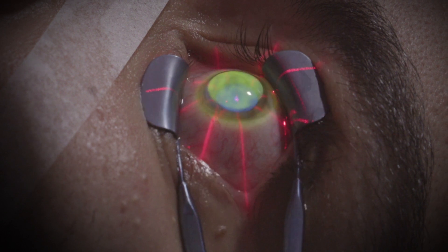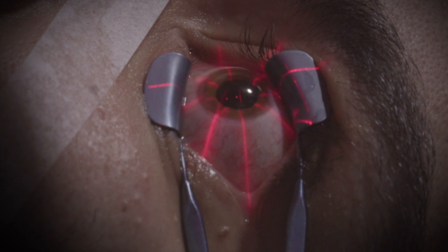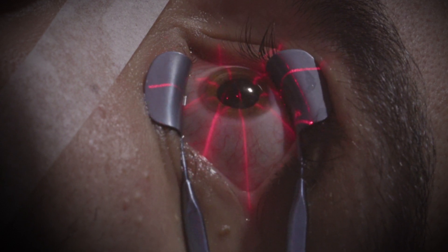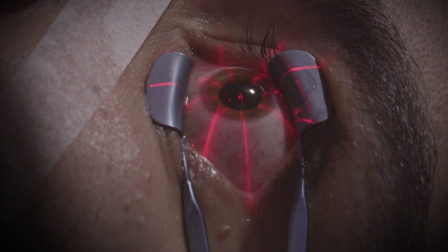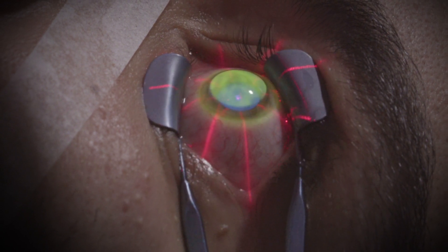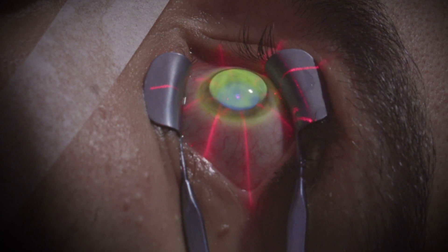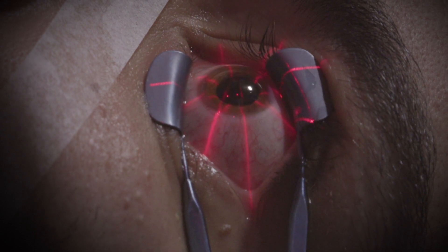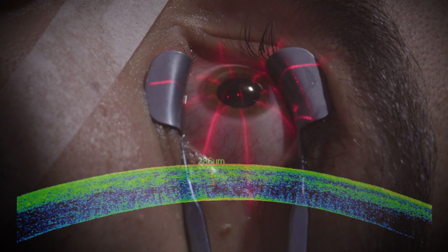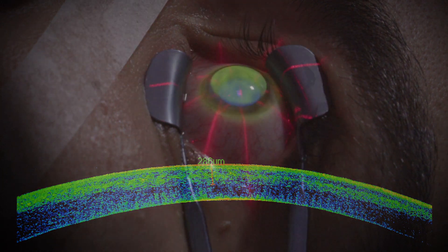Moreover, we have increased the fluence, enhancing the treatment from 5.4 joules to 7 joules, in order to compensate for UVA photo-attenuation by the corneal epithelium left in situ. This increases the penetration of the treatment, obtaining a deep demarcation line at about 280 to 300 microns of stromal depth.